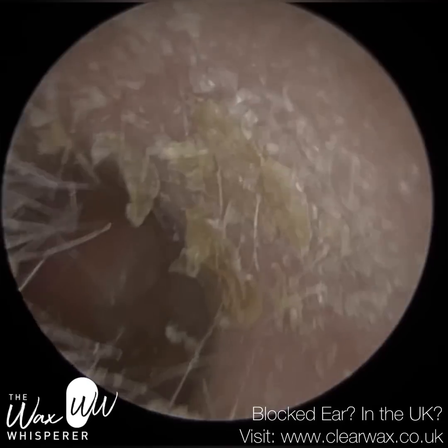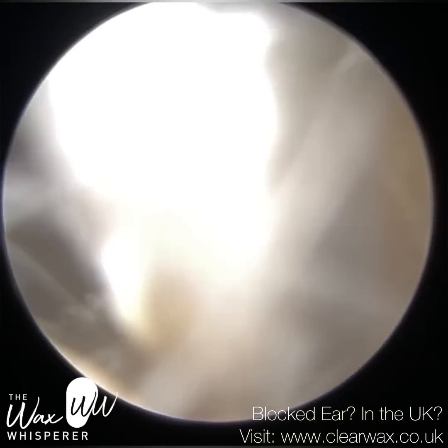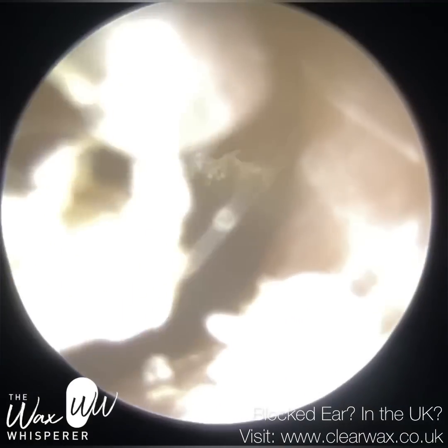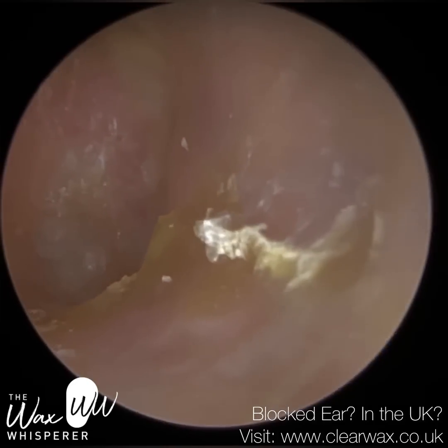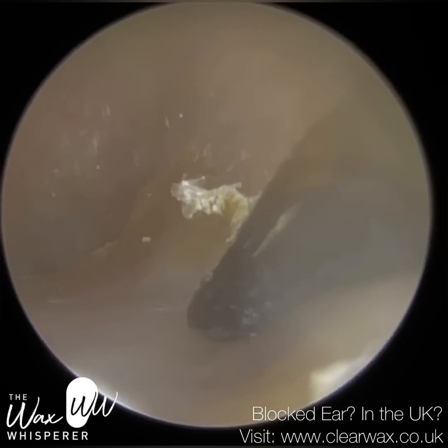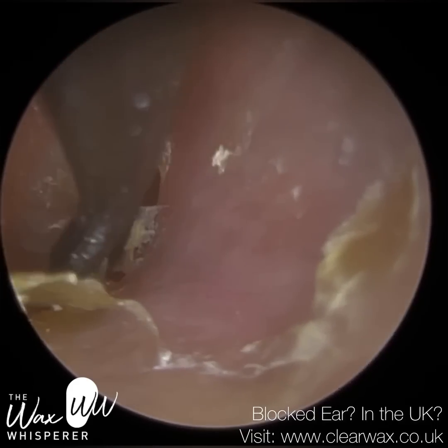But yeah, sometimes that bulge at the bottom, the granulation tissue, is hiding possibly something a bit more serious underneath, something called a glomus tumour. So it's a vascular mass that can develop normally, as I said, at the bottom part of the eardrum, but this is behind the eardrum. We call it the rising sun sign when you get a blushing or redness from the base. But a typical symptom of that is pulsatile tinnitus if it's a glomus tumour. I mean, there are other different middle ear vascular masses that can be present that don't present in pulsatile tinnitus. So pulsatile tinnitus is when you hear the rhythmic beat of that vascular mass hitting against the inside of the eardrum.